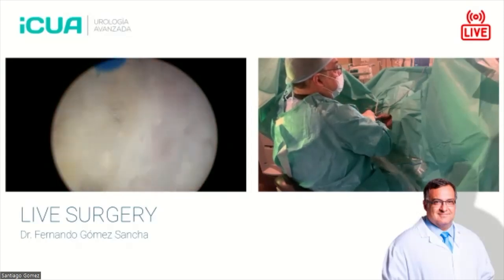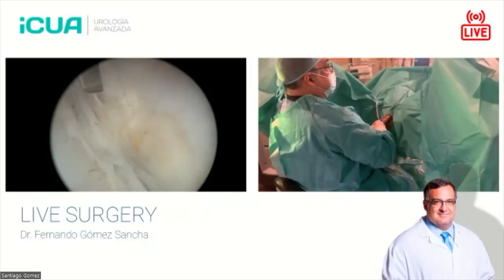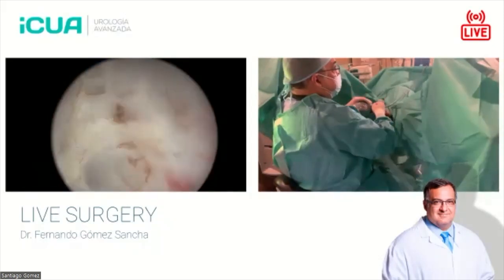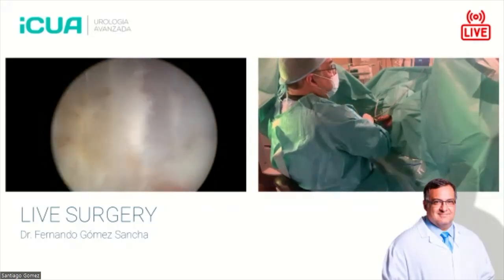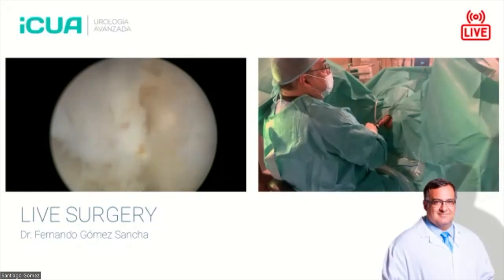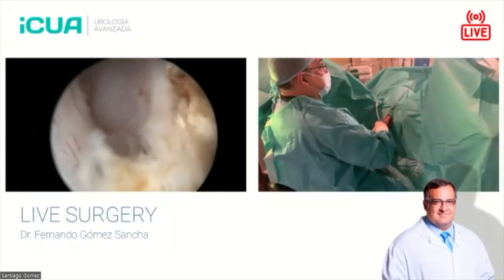So here you see I'm following my line of dissection. Of course, I'm trying to understand, and I really trust my line of dissection, because once you are at this depth, it's not very difficult, especially with holmium. Now, of course, there are other lasers on the market, such as pulsed thulium lasers and thulium fiber lasers. They cut really well and provide very good hemostasis, but they do not have the dissection effects that the holmium laser offers.